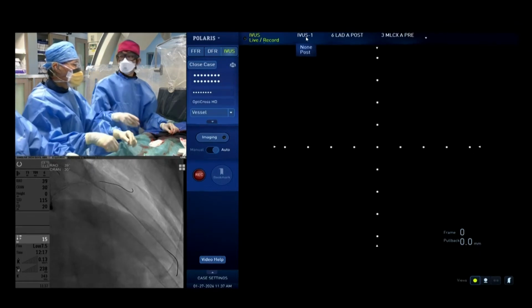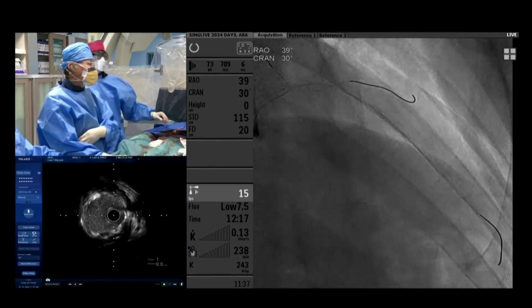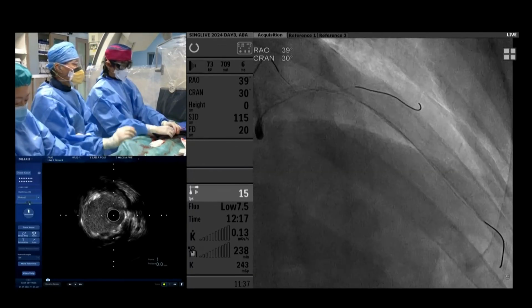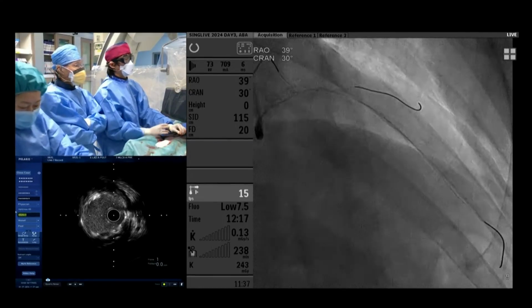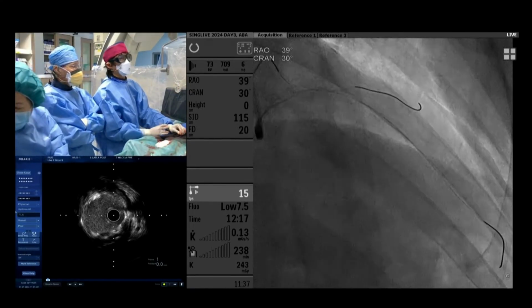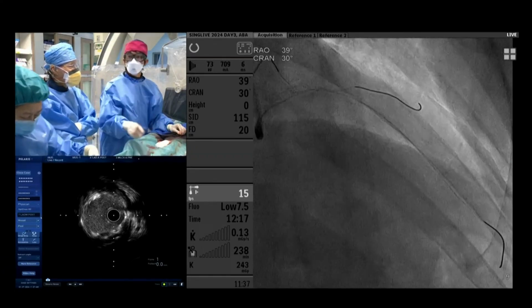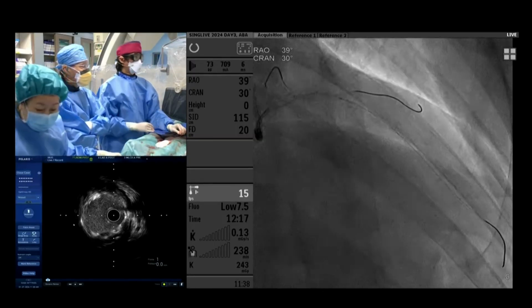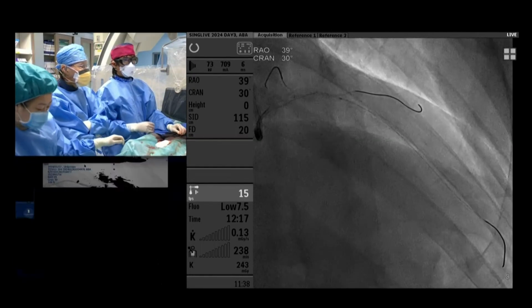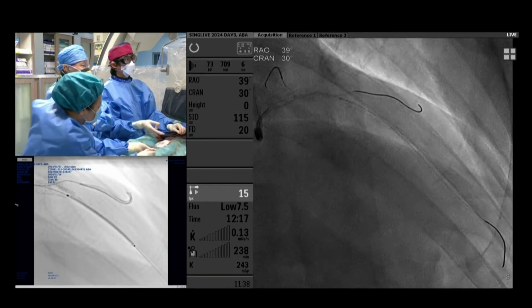Because now you implant, luckily for us, maybe we didn't implant directly at the ostium, maybe just slightly in, so not so high a risk. But if you're right at the ostium, then your guide might be sucked in while you're removing your guide wires, those trapped wires, and that can concertina the proximal stents. Some stents do not have such strong radial force, so that might happen.